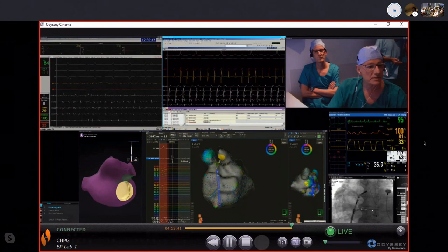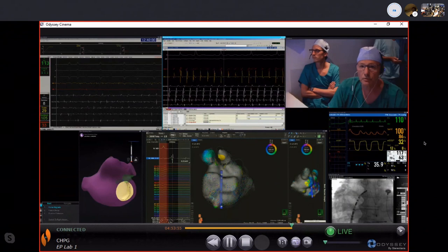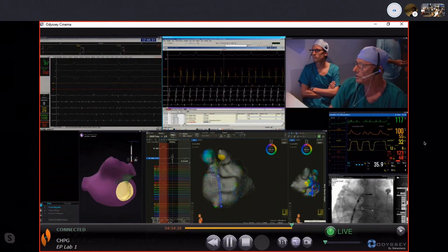Thanks a lot. Yeah, just a very brief update on where you're at. This is Nadir Saoudi. Gabriel is just manipulating the Orion at the moment. And we gave several pulses on what we identified as possible rotors, and it didn't do really something. And now that we are doing a remap, there are very long periods where an organization appears while we are mapping, and it stays in the form of a regular atrial tachycardia for periods of 15, 20 seconds and reverts back to AF, and we continue, but it's a clear improvement compared to what we've seen before, because this kind of prolonged period of organization didn't occur before we started ablating these potential rotors.